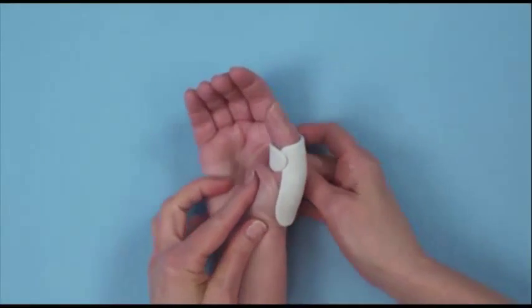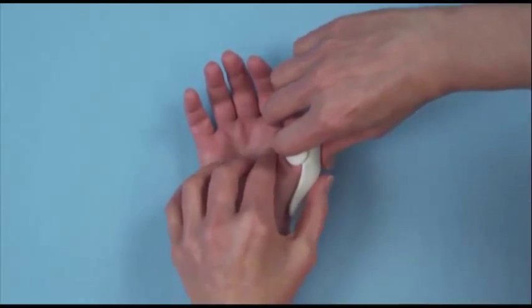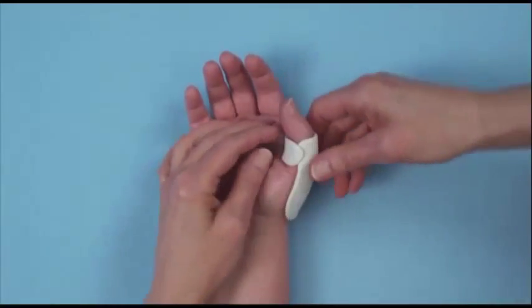While maintaining the desired amount of MP joint flexion, gently lift the proximal phalanx while continuing to smooth the contour dorsally over the MP joint.